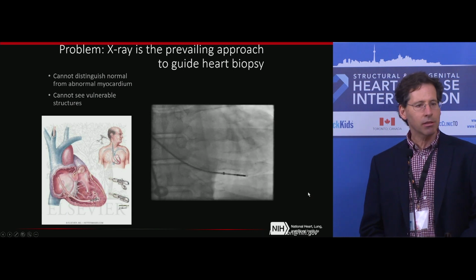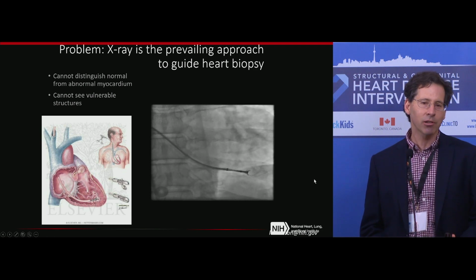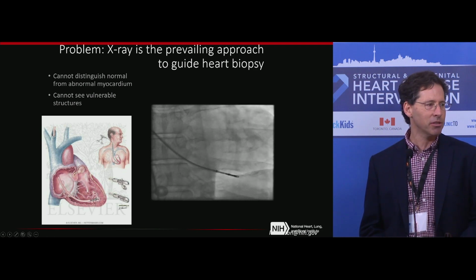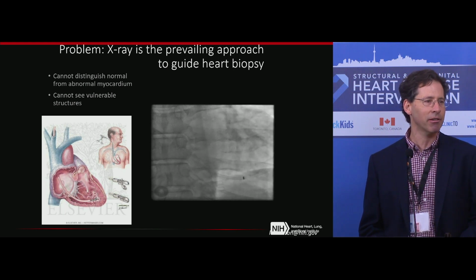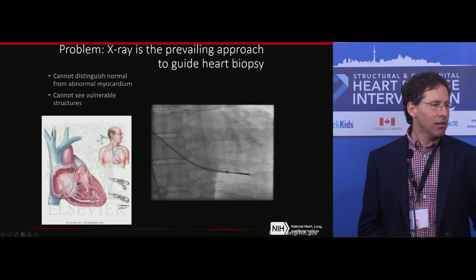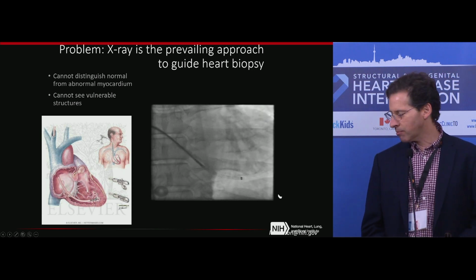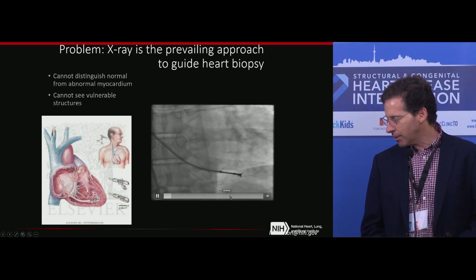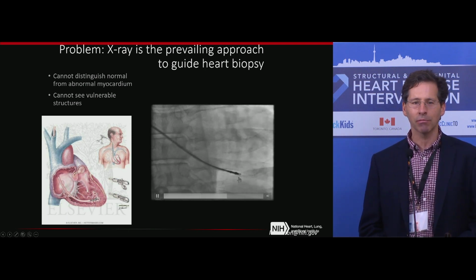Okay, so you know that myocardial biopsy is stupid. It's stupid for a lot of reasons. We don't know how to look at our specimens. You might as well throw them in the trash. They'll be just as sensitive for pathology. Just make up the reports and it'll be just as accurate, right? And so, if you have a diffuse disease, that's fine, and that's why we're looking for other markers of, for example, transplant rejection. But if you have a focal disease, I mean, Jesus, that's stupid to use X-ray to guide your bioptome.